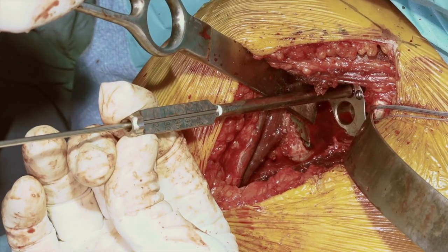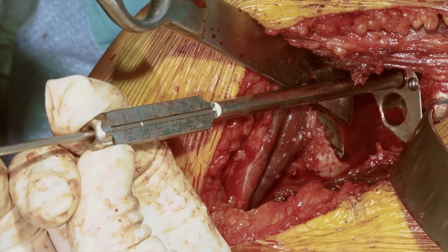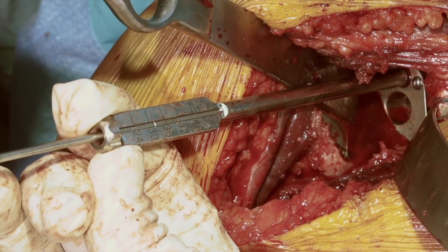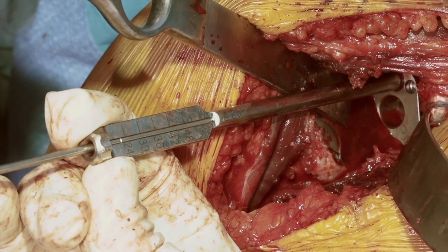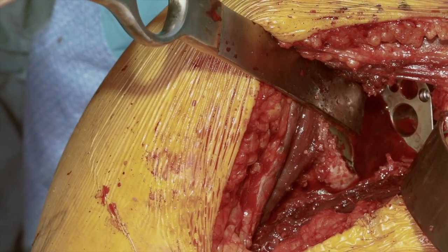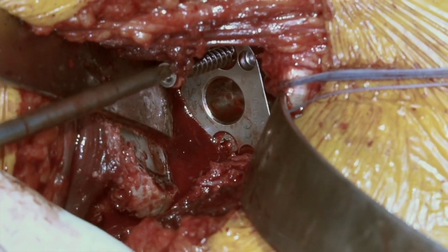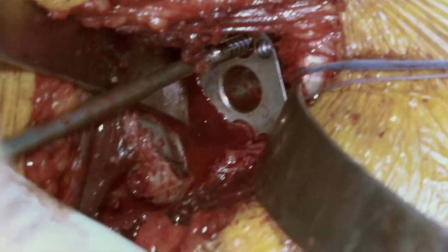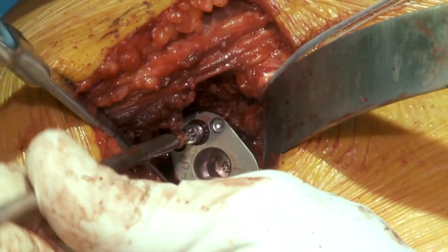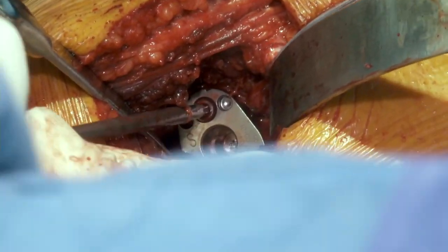We're paying attention to how deep our drill is going — there's the 24, there's the 30. I still have good bone contact. Starting to hit harder bone, so it looks like it's going to be the 36. The 36 it is — that's where we want to be. We'll undo our drill guide, back out our drill, and take the 36 screw to finalize the seating and fixation of our base plate. These base plates have been spectacular in terms of their fixation — we haven't had any of these come loose. The only time a removal has been done has been for infection. As we get close to the actual base plate, it'll engage the grommet and lock it into its final position, nice and secure.